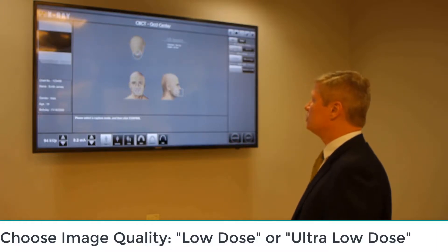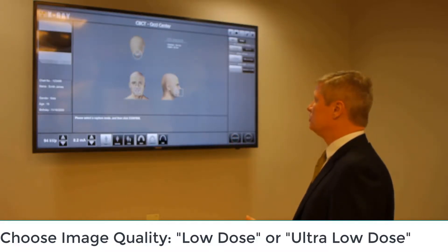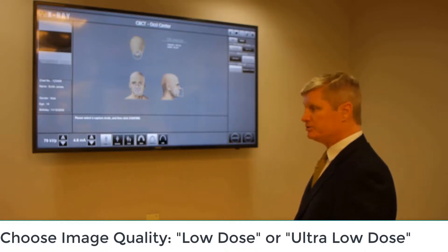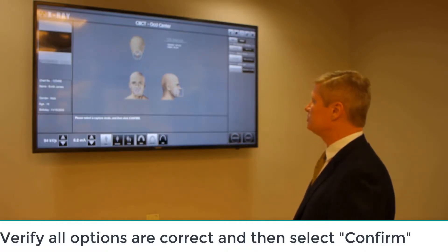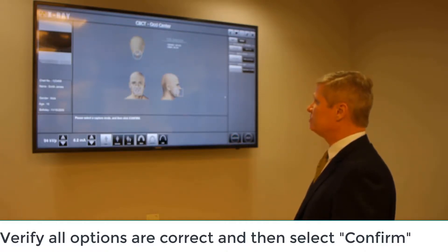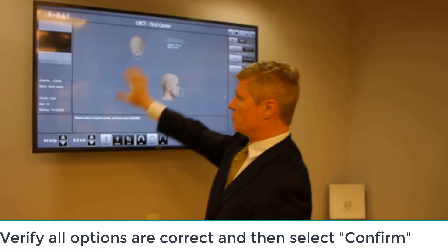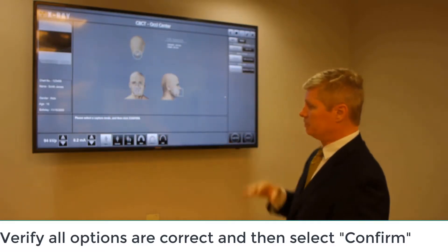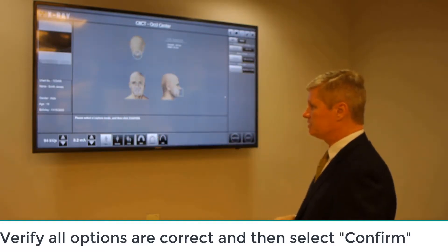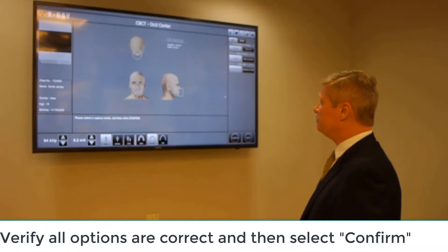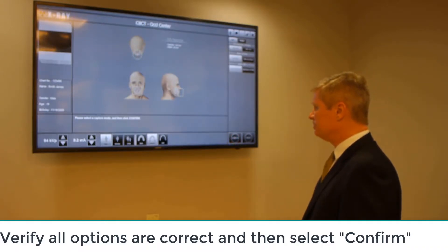Once we've chosen our field of view, we're going to choose low dose — so ultra-low dose would be ideal for doing pediatrics; otherwise, keep it under low dose. Once you've verified that the information is all correct — patient chart, your exposure settings at the bottom, field of view, and image options — click on Confirm.